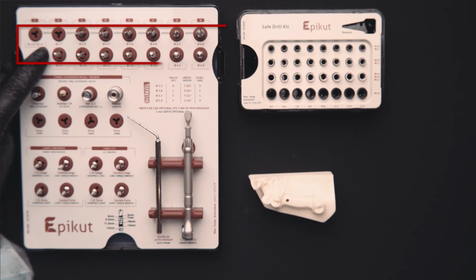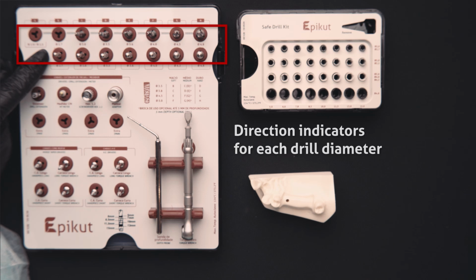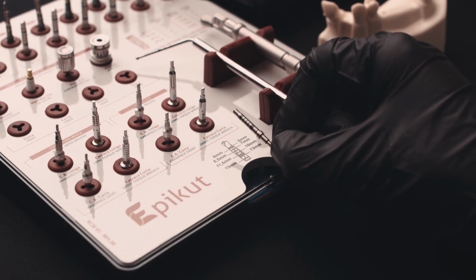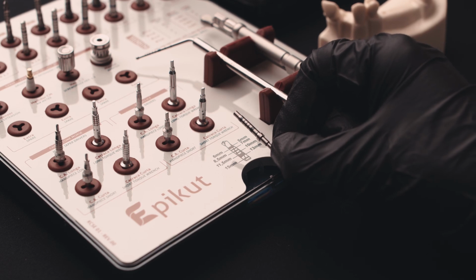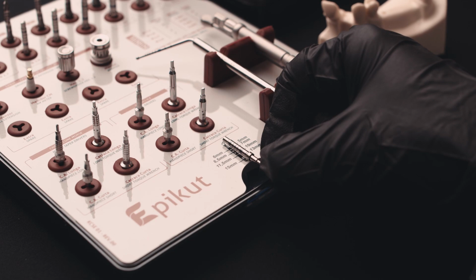In the line below, there are direction indicators for each exact drill diameter. This way, we avoid any mismatch of the direction indicator. In case of doubts about the millimeter markings of the direction indicator, use the real scale that is marked on the kit.